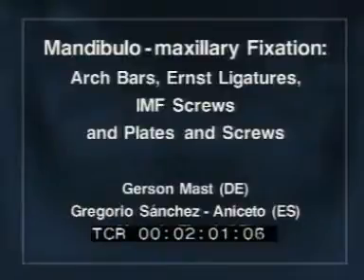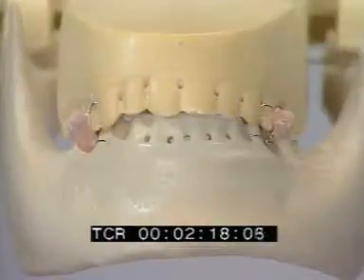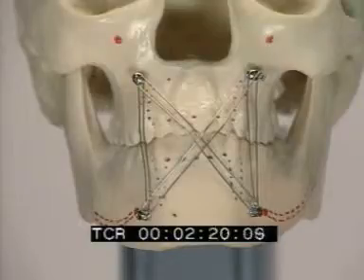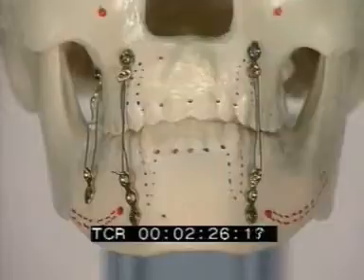A correct mandibulomaxillary fixation technique is the key to successfully establishing or preserving dental occlusion in facial trauma and reconstructive and orthognathic surgery. The use of arch bars, Ernst ligatures, IMF screws, and plates and screws are the most common techniques for mandibulomaxillary fixation in dentate patients.